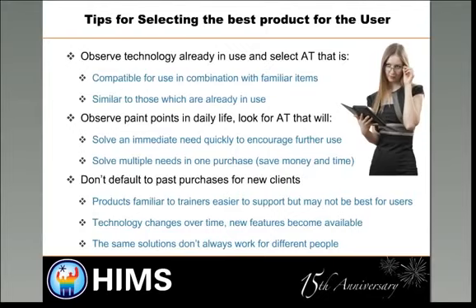For example, if you have an individual who doesn't use any technology, they don't have a smartphone, they don't have a tablet, they're not fond of using computers, almost everyone in America has a television, and almost all televisions these days come with a remote control. So the eBot, for example, comes with a remote control. That might feel similar to some people who use a television. They can use that remote control to increase the magnification and decrease magnification, very much like they increase and decrease the volume.